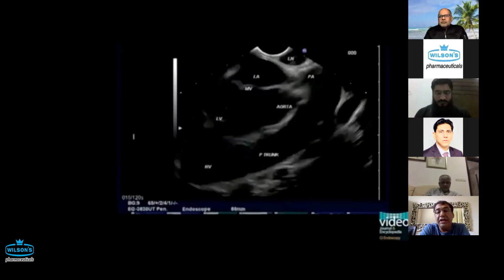So other things, I already explained that. From a practical point of view, the mediastinum is the last thing I look at during my EUS examination. Coming from down up is easier for finding these landmarks than going downwards as soon as you enter the esophagus.